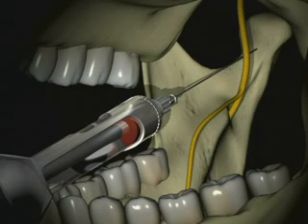We should ask the patient to keep their mouth open for about 1 minute if possible, as it is believed that this keeps the mandibular nerve closer to the site of injection and therefore improves onset of anesthesia.